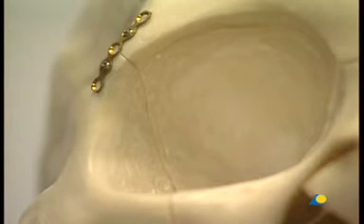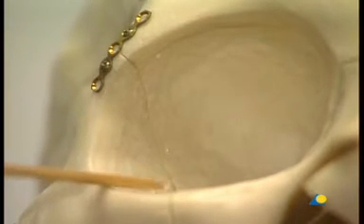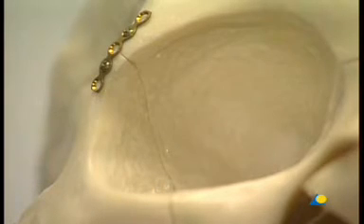Confirmation of the correct three-dimensional reduction of the zygoma is made by an intraorbital examination of the lateral orbital wall. It's important to make sure that there's no step-off between the greater wing of the sphenoid and the zygoma. During reduction of the zygoma, the alignment of the lateral orbital wall should be reconfirmed.